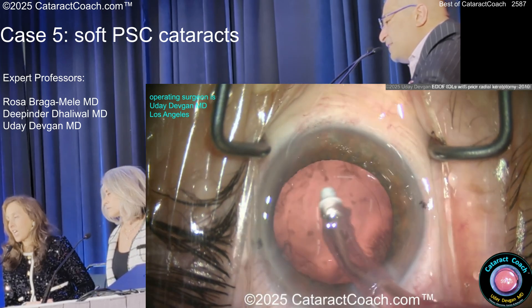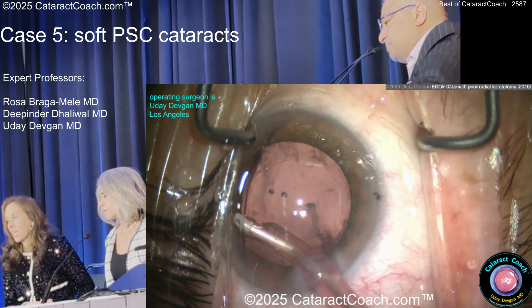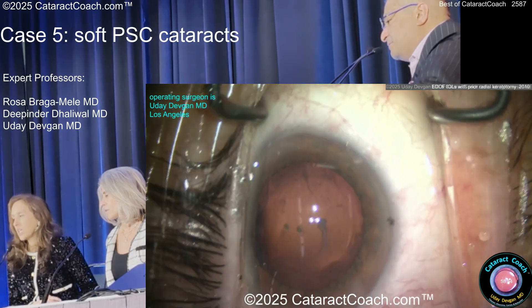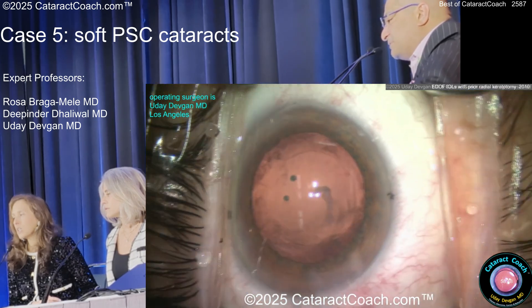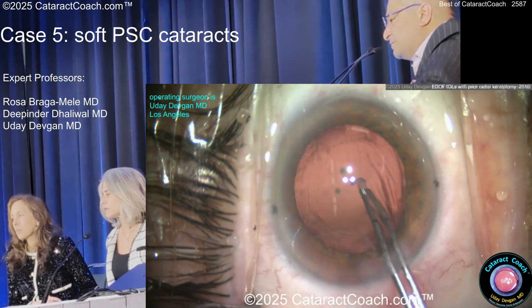Now look at this — there's some gooey stuff. It's a different case, PSC, I'm operating, so don't be too mean. What's that thing on the posterior capsule? Should you get that or not? I can't get it up with the aspirator. I would visco-dissect it. I'm trying to inject some viscoelastic but nothing happens. Did this patient have a vitrectomy or trauma? Am I being crazy? You're going to peel it?